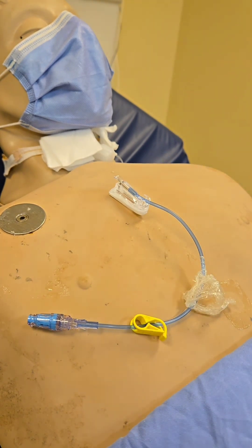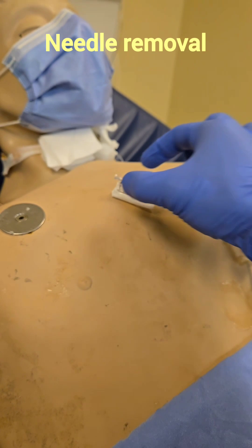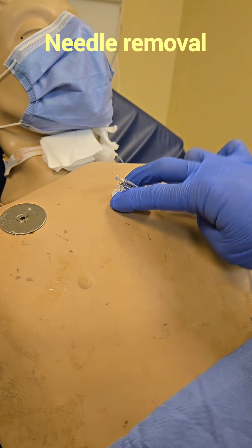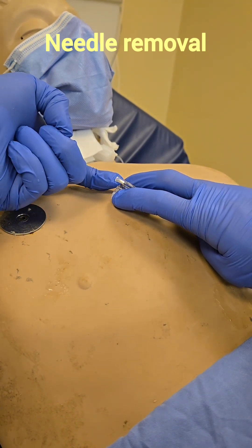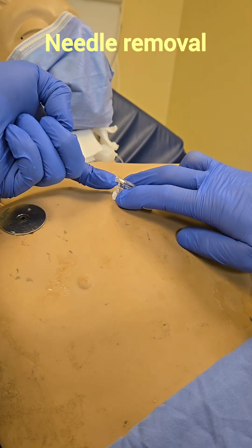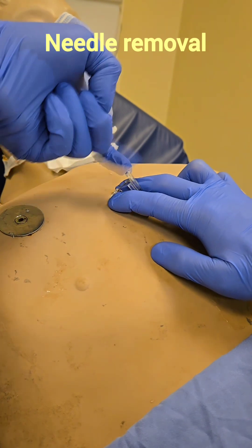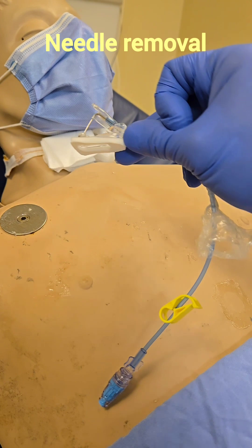Now that we have flushed and heparin locked it, we can remove the needle. The proper technique is not to just grab it and yank it out — that is extremely painful for the patient. Grab two fingers to stabilize the portacath, use another finger to grab the little part sticking out, and pull up almost like opening a can — you'll hear a click. Then dispose of it in the sharps container.